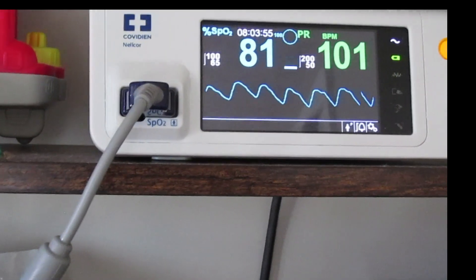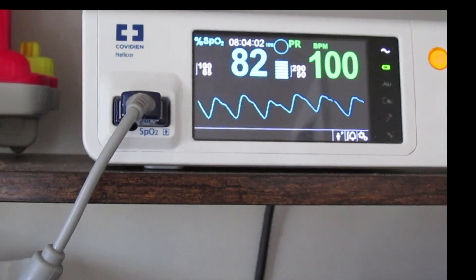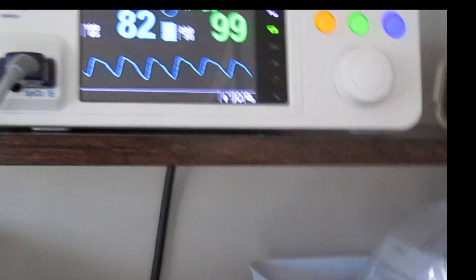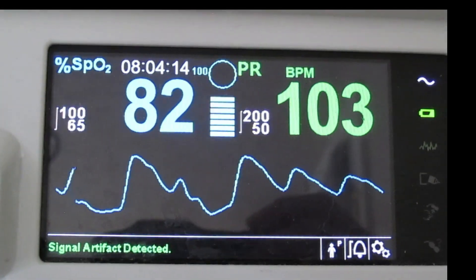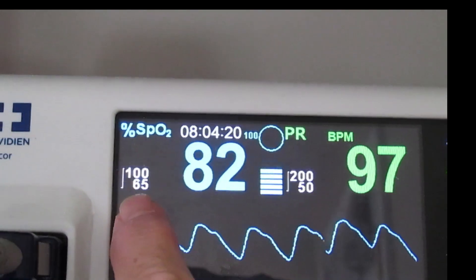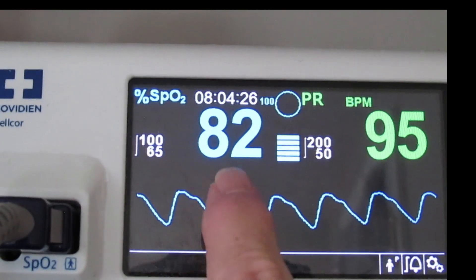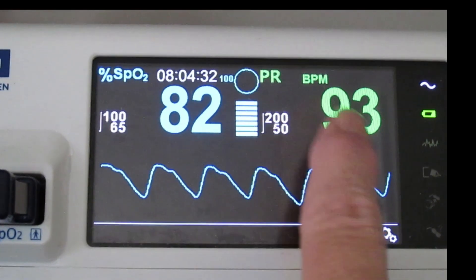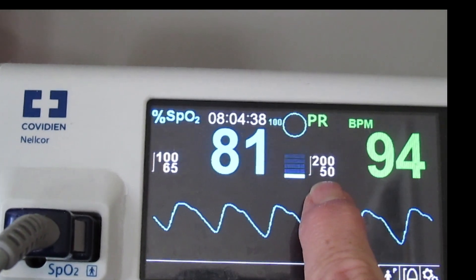This kind of averages out the heart rate and SpO2, and the waveform is indicative of a steady reading without interruption from activity. The other thing we want to talk about is the readings on this pulse ox. As you can see, his alarm for oxygen is set at 65 — so when his oxygen gets less than 65 this will alarm. For heart rate, the alarm triggers when it's over 200 or less than 50.